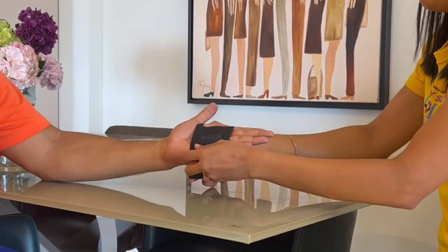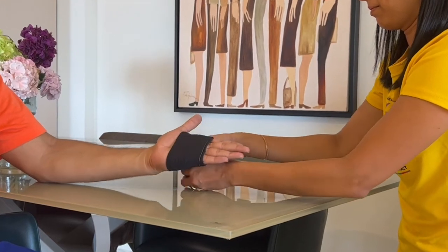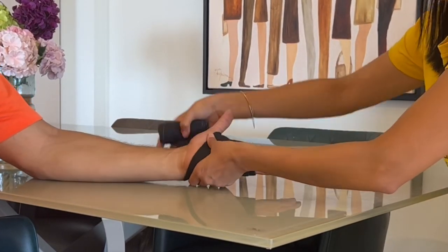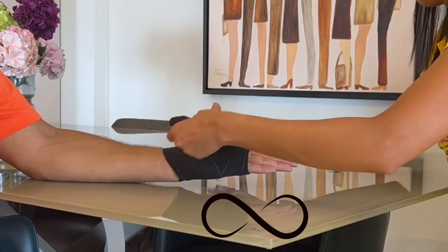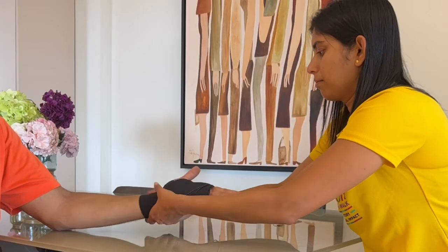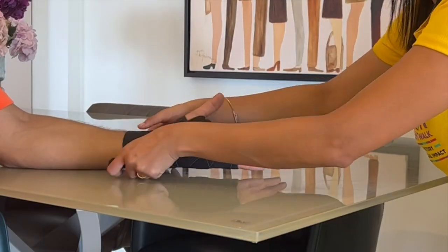For the wrist joint, we'll follow the same pattern as the ankle. A few wraps around the hand to start with, then we go into the figure of 8 pattern again. Make sure that you don't apply the crepe bandage too close to the thumb. Then we end up by applying the last few rounds around the wrist joint for stability.